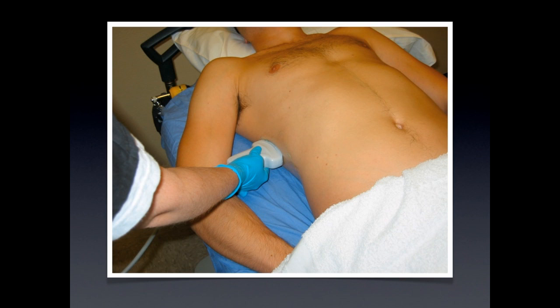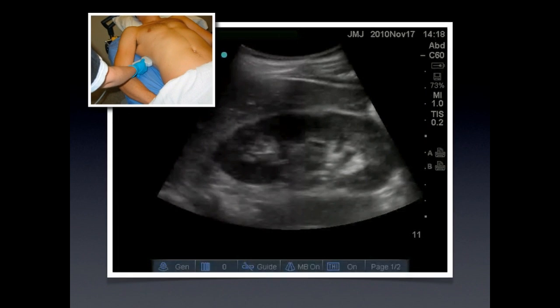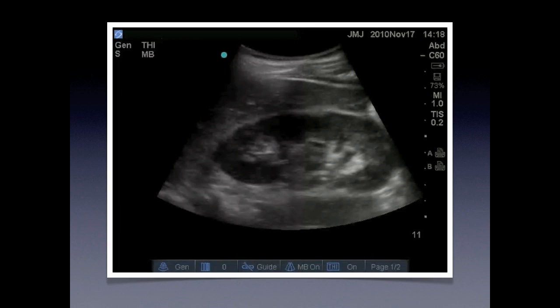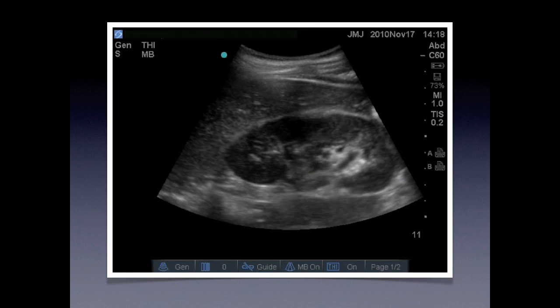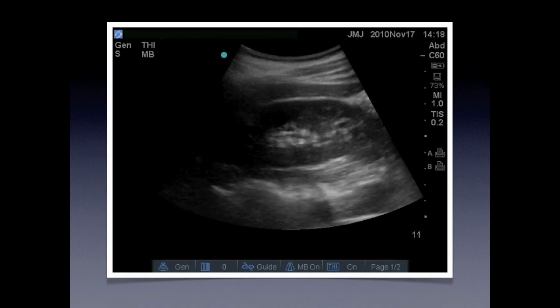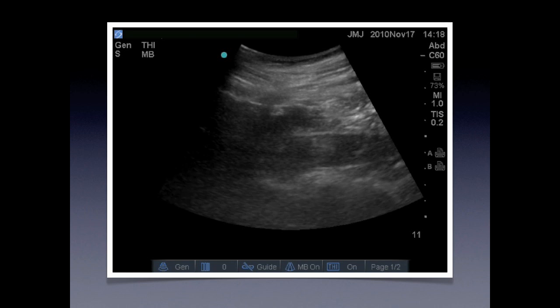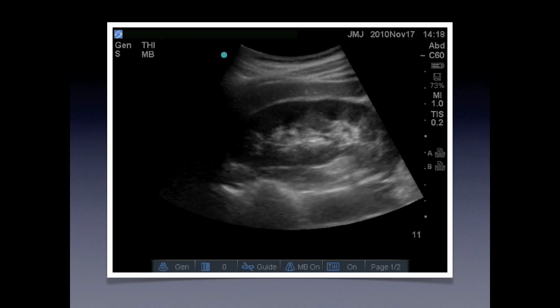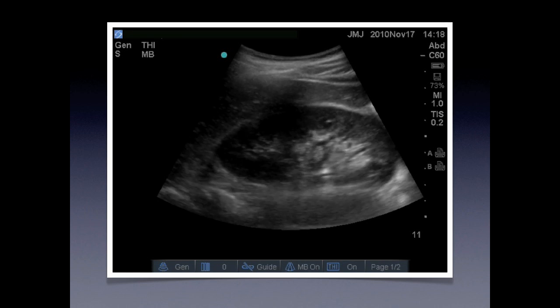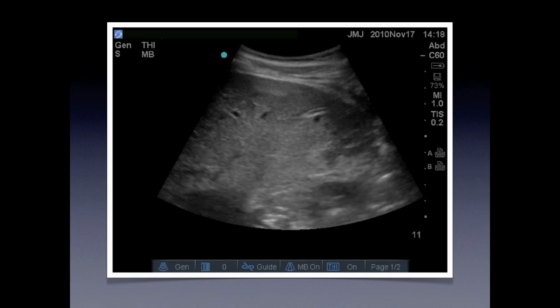We're going to sweep up and down so we can visualize all of the anatomy. Remember, the image on the screen is about 1.5 millimeters in thickness, so you really need to sweep up and down to get the full view.